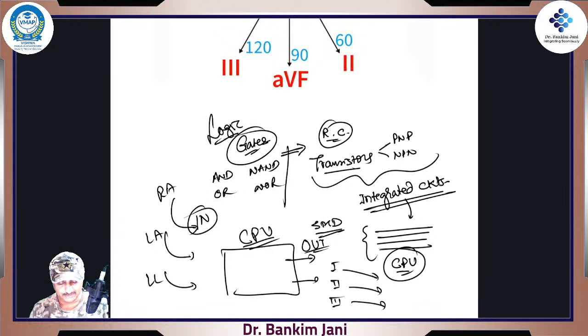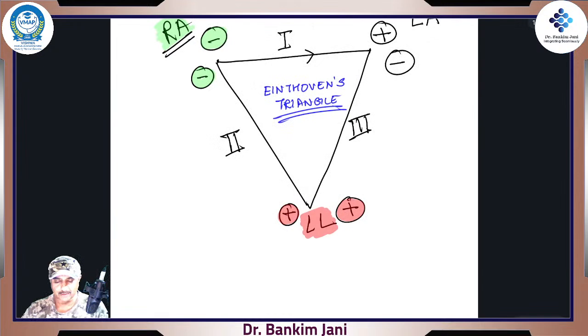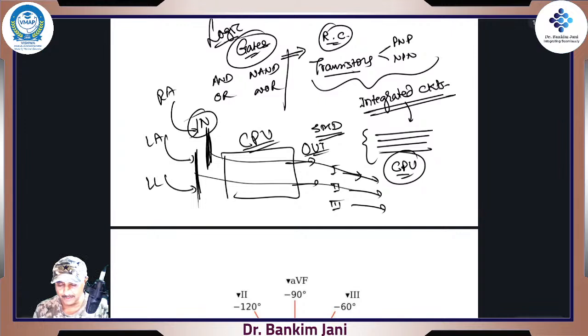It takes, okay, right arm, left arm, right? You both are now operational, right? Whatever your feed is, that feed goes into lead one. Within a microsecond, it flips. It flips between, okay, left arm and left leg. Now, your output would be going all the way to the lead number, right? Over here, it'll say lead number three, left arm, left leg. So it will say your output would be fed to left leg, and that is getting displayed.